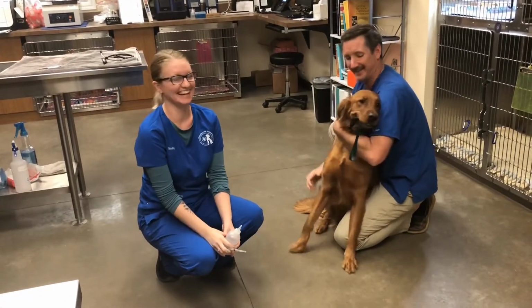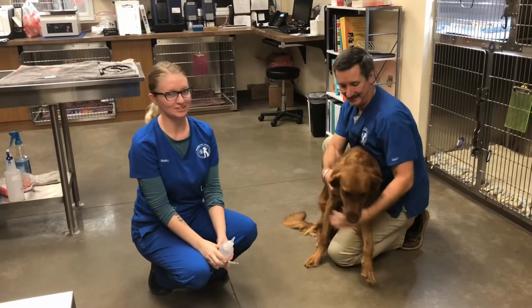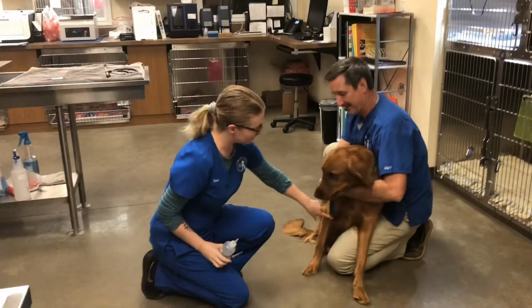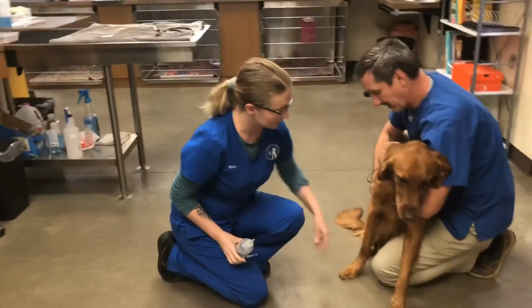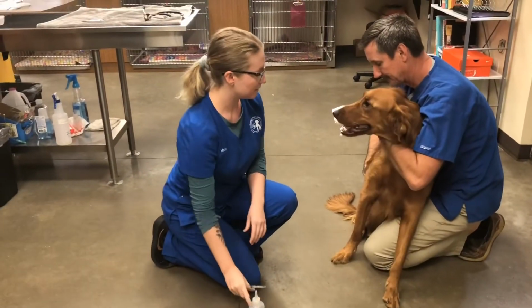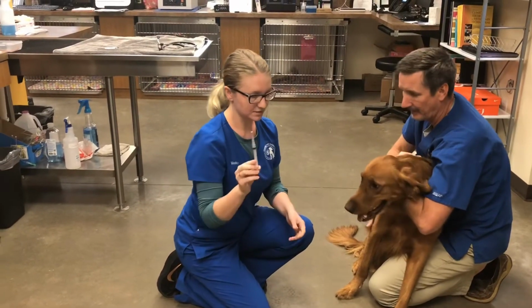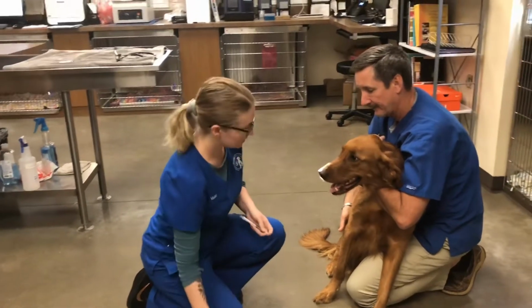Okay, now I'll be demonstrating a blood draw from a canine patient's cephalic vein. The cephalic vein runs along the dorsal aspect of each forelimb, so I will have my restrainer occlude the vein for me by holding off. And then I will use a 3cc syringe with a needle on it already to draw my blood.